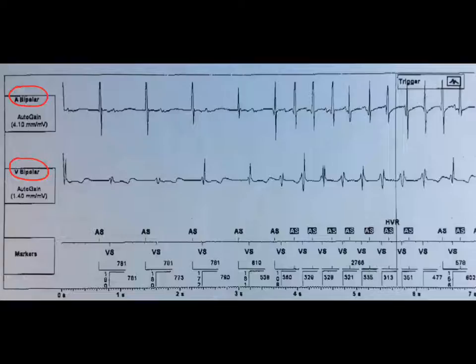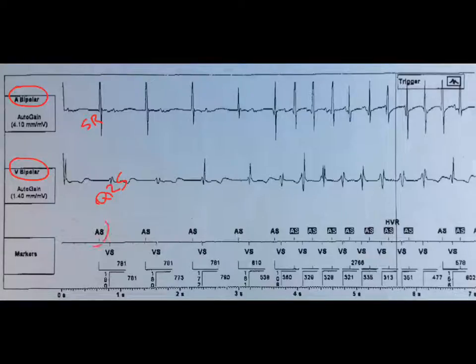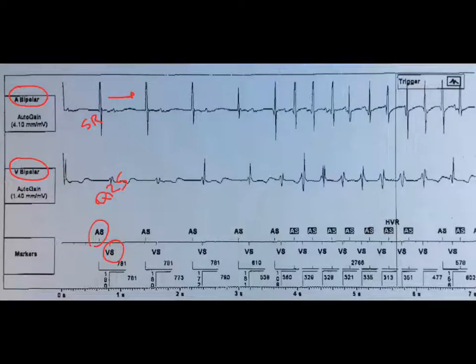The first bit I'm going to call sinus rhythm. The second bit we're going to call a QRS. In the markers, we have atrial sense from sinus rhythm and ventricular sense from the QRS. As we move in time, this is an A sense — it's a P wave.